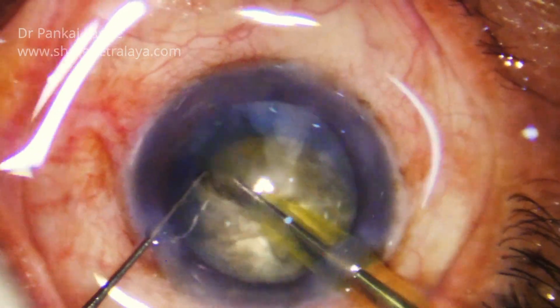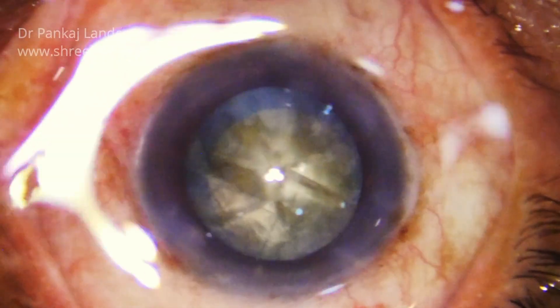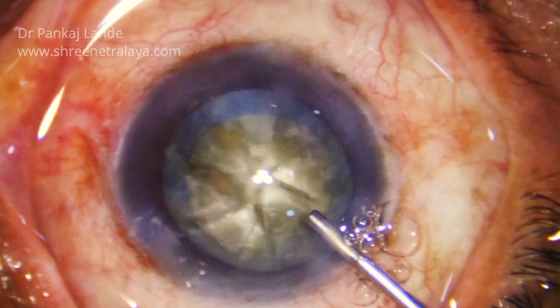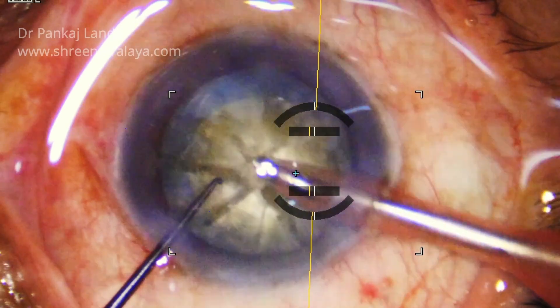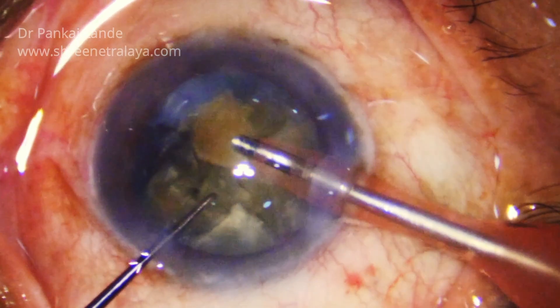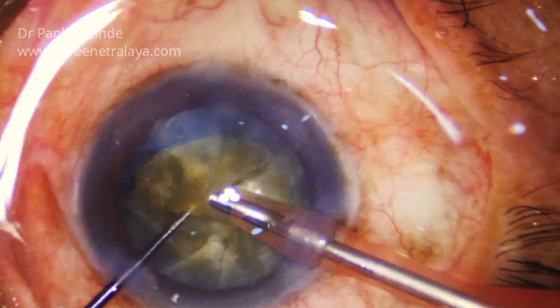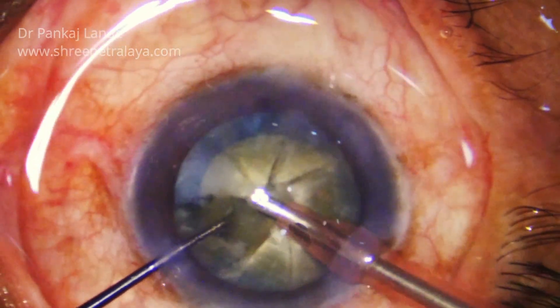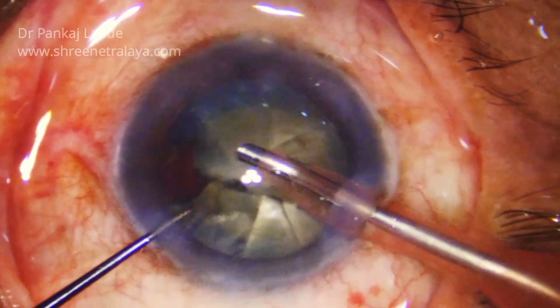The flow was on so the anterior chamber was stable even during pre-chopping. Now again Visco is injected in the anterior chamber and you can note each and every piece is well separated. Now I have shifted to a routine FACO probe and you can note that each and every piece is well separated and can be taken out very easily with the help of the probe.